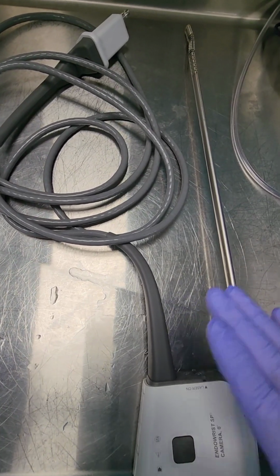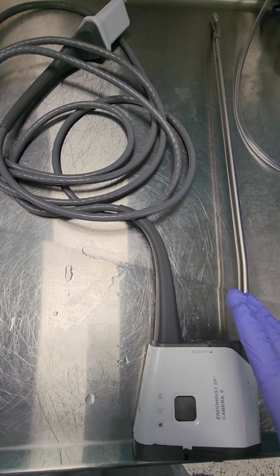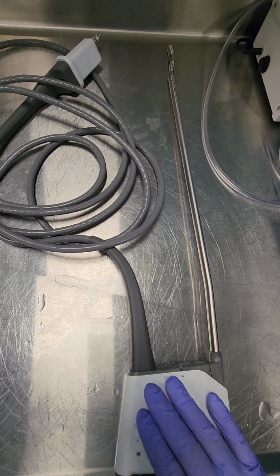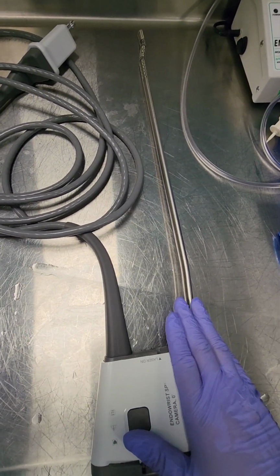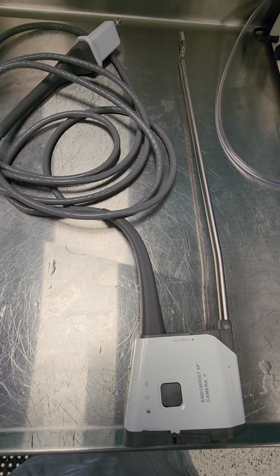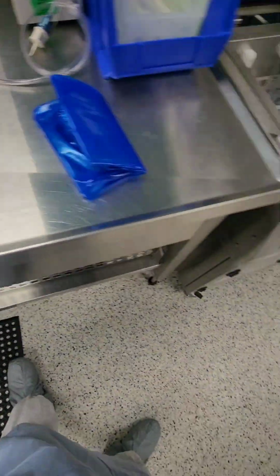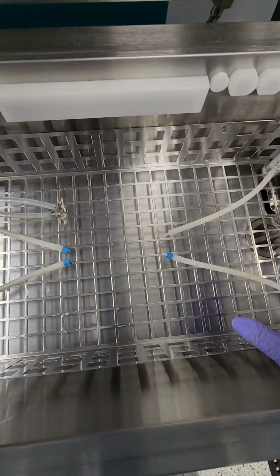Okay. So you want to make sure that you're not damaging the instrumentation. Soak it very well. Make sure you're inspecting for cleanliness. Press those lock buttons to make sure that they're functioning. And just overall, follow the IFU for this specific device. It is very similar to the XI with just a few extra steps there in the process. But it's rinse, it's soak and prime, soak and wash. Then you're going to transfer to cool water and do the flushing. And then the brushing again prior to going into the ultrasonic.